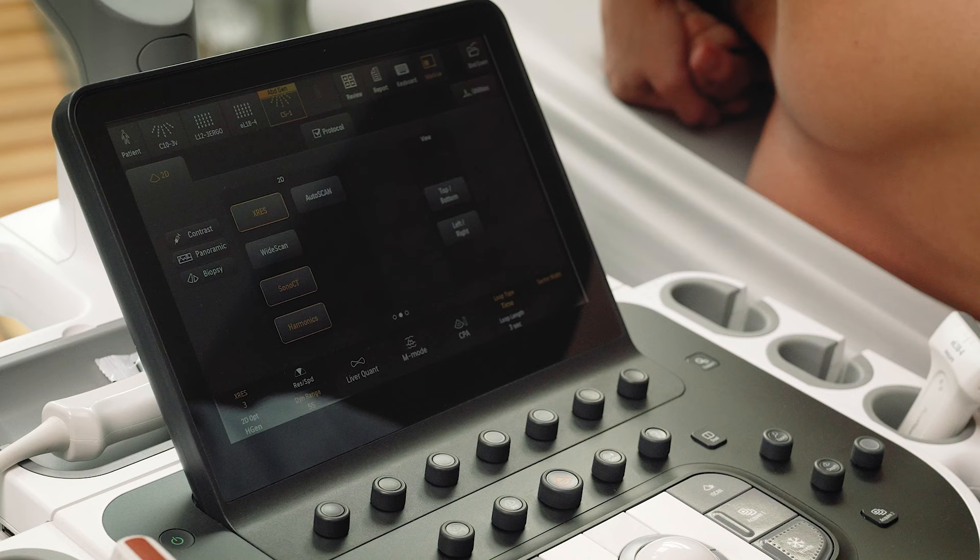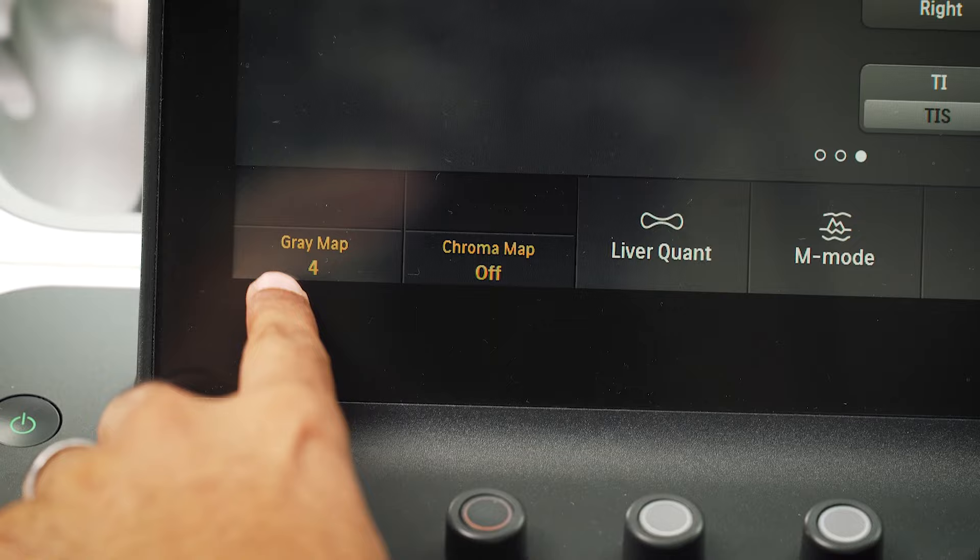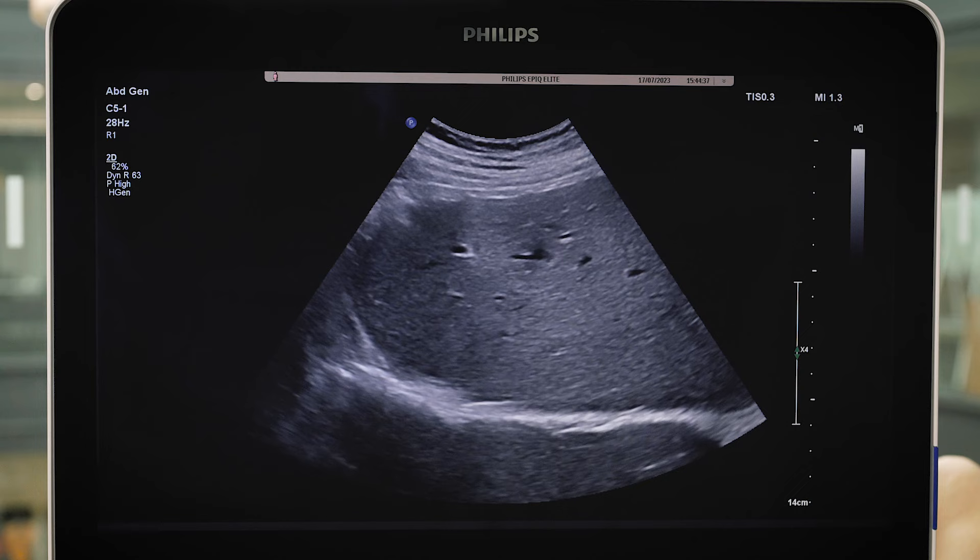Grey maps further adjust the levels of grey within the image. There are five grey maps, with one having the least grey fill and five the most. Grey maps can be optimized for user preference.